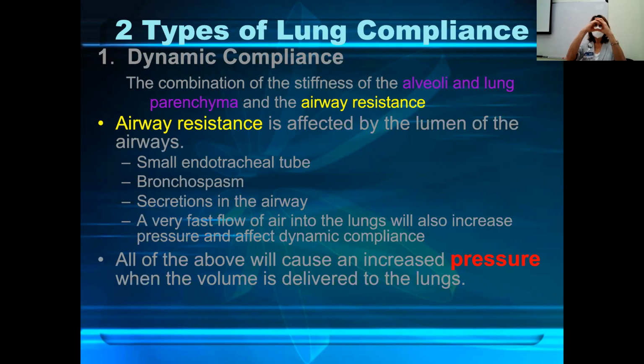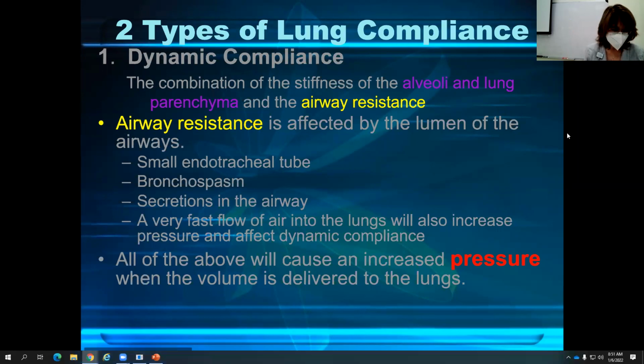Now imagine trying to put air through a really small opening or lumen. When you try to push the air through, it's a lot harder because it's a smaller space, and that smaller space creates a lot of resistance to airflow. It kind of inhibits the airflow. Maybe that would be a good way to describe it. It inhibits airflow.